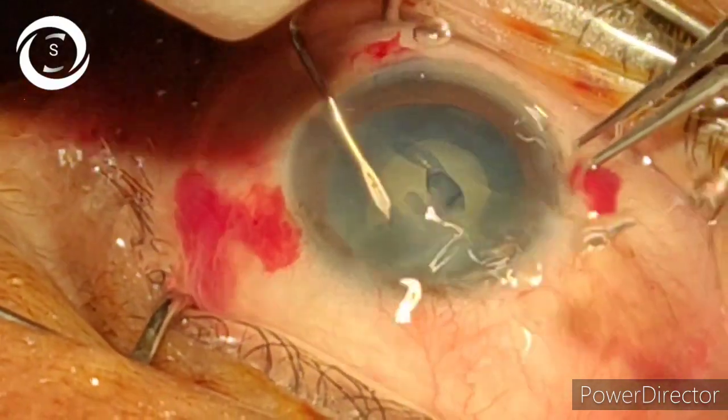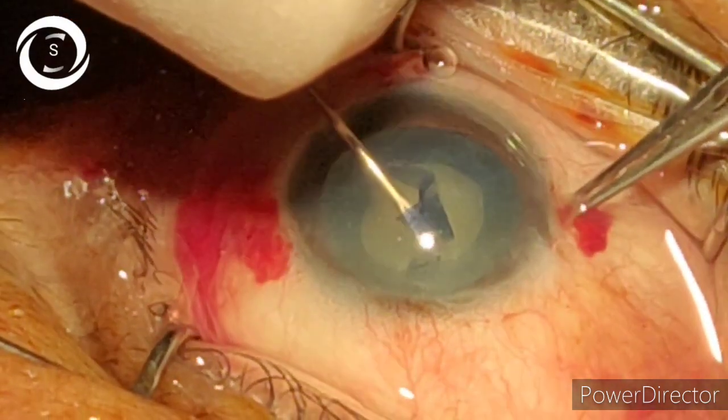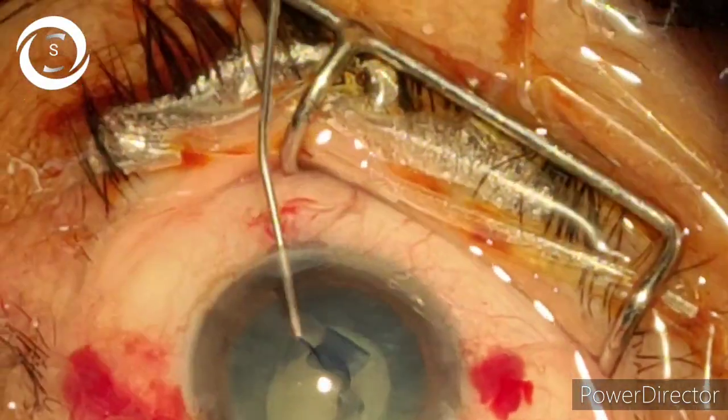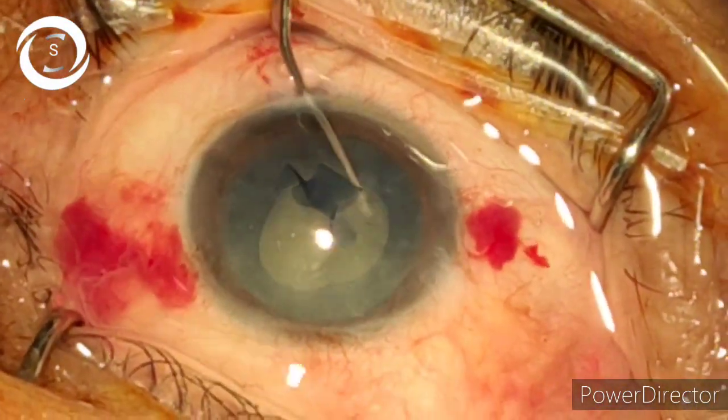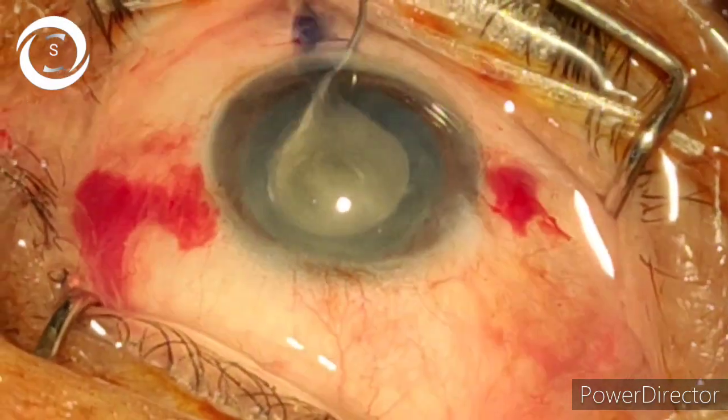Now you can see that I am performing capsulorhexis. Capsulorhexis has been done and now I am performing the hydrodissection.